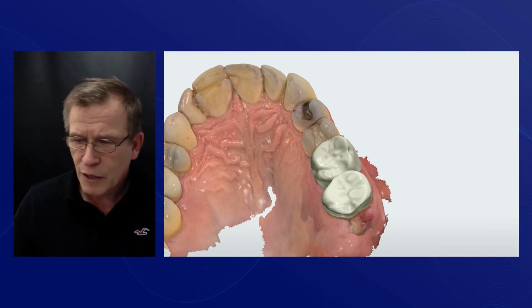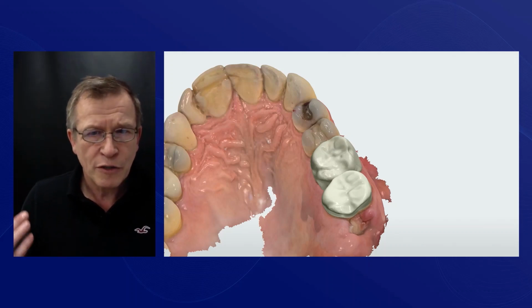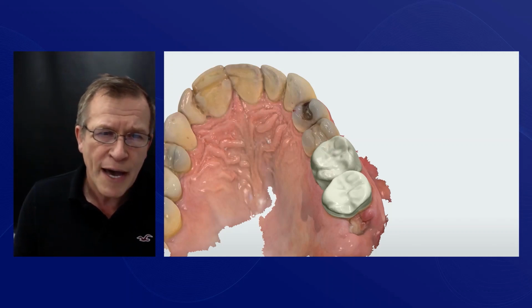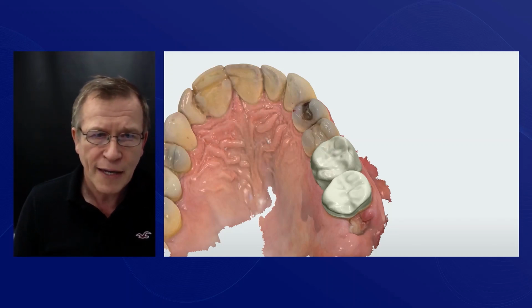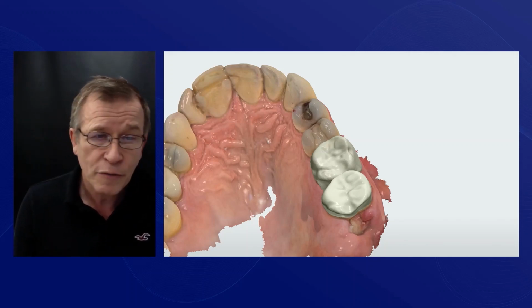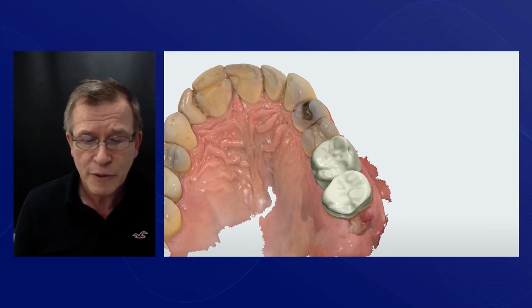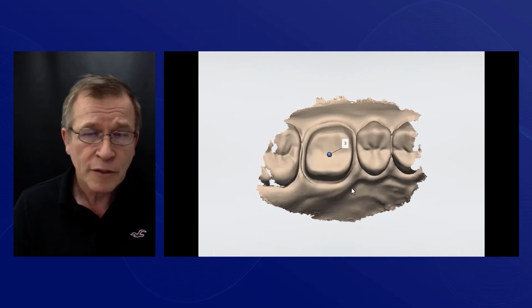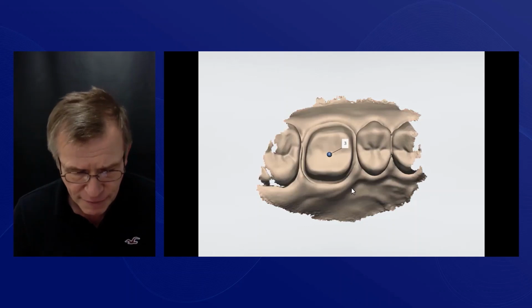I think also, a lot of these things we would think about being lab generated. I think the fact that we can do this for the patient, they don't have to come back, they don't have to get numbed up again, we don't have to open the tooth up again. All these things have got to be good for the tooth, they're going to be good for the patient, and they're definitely good for our productivity and efficiency within the practice. So, there's a lot of cool things, again, little things that sometimes I take for granted and forget.